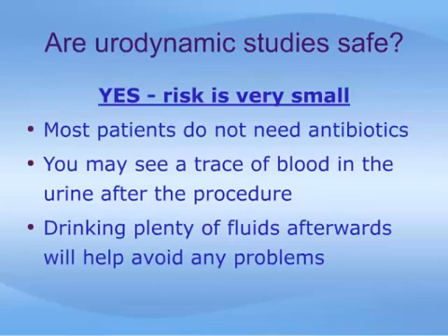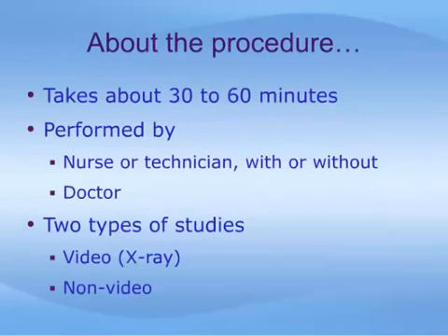There is little in the way of risk associated with a urodynamic procedure. Bladder infections rarely do occur afterward, but antibiotics are not routinely used for everyone. Drinking plenty of fluids after the procedure will reduce the risk of infection and also help to clear the small bit of blood that you might see afterwards.